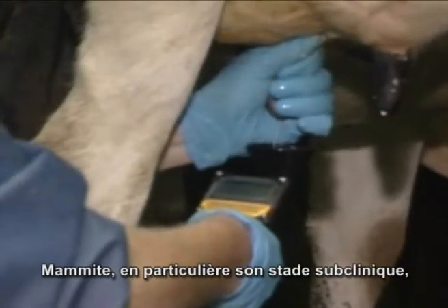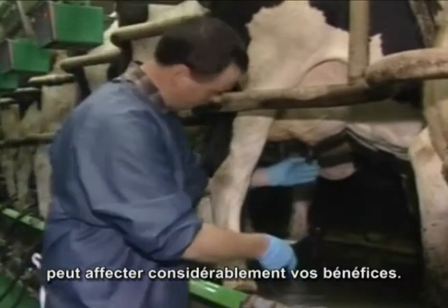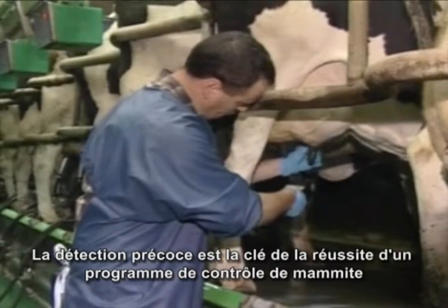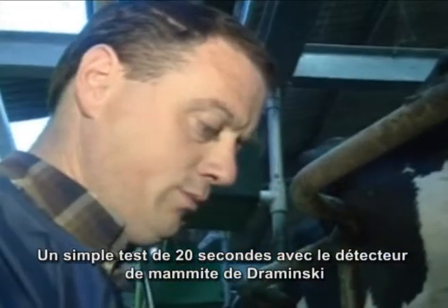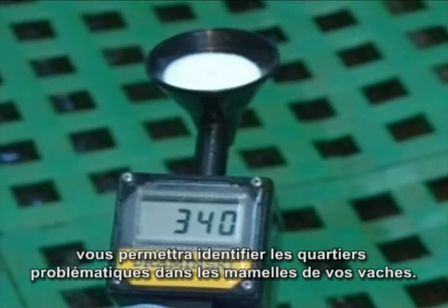Mastitis, and in particular subclinical mastitis, can have a serious effect on your profit margin. Early detection is the key to a successful mastitis control program. A simple 20-second test with the Draminsky mastitis detector will help you identify problem quarters in your cows.